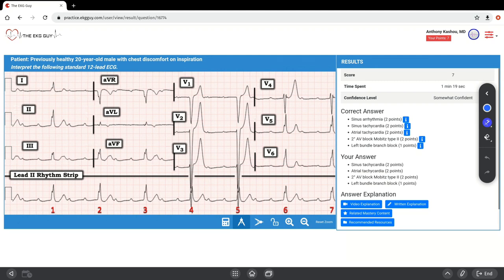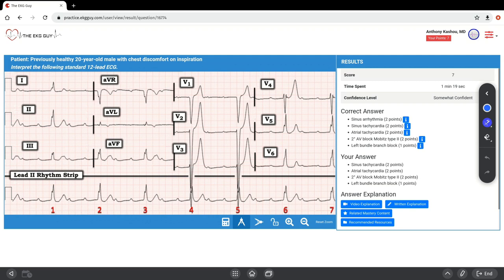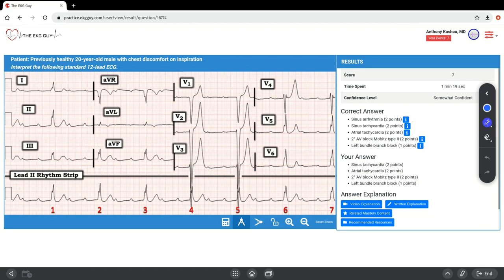What can be difficult to appreciate is the presence of ventriculophasic sinus arrhythmia, which tends to be more common with second-degree and third-degree AV block. In general, the shorter PP interval is the one that contains the QRS complex. The thought behind this is that cardiac perfusion improves following ventricular contraction, thereby resulting in slight shortening of the P to P interval containing the QRS complex.